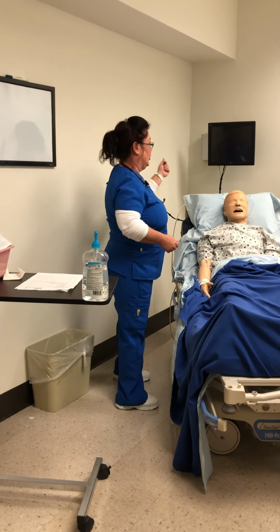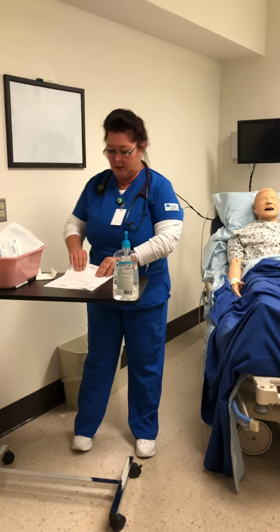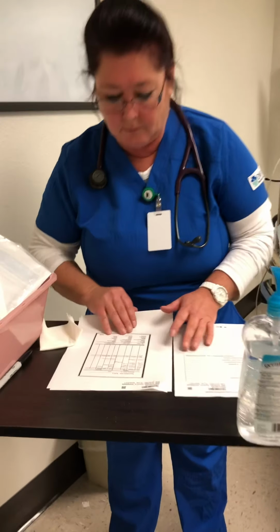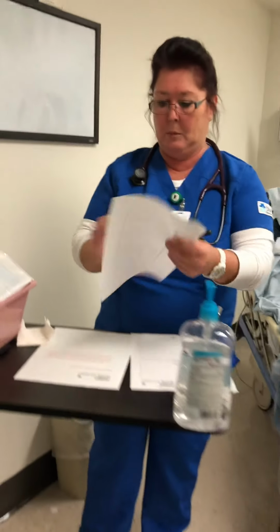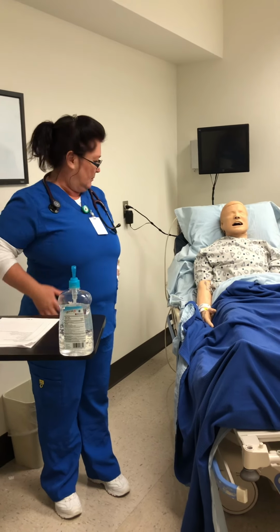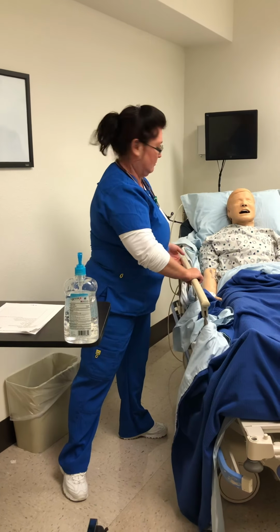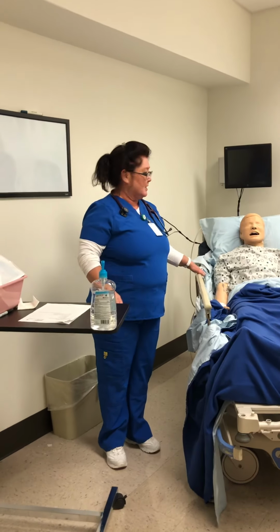So I've unhooked from the suction, and I've got the numbers that I need. So I'm going to come over here, and I'm documenting. I have totaled everything up. And I am putting, whoops, before I leave the room, I'll put the bed rail back up to keep her safe in bed. Shirley's good, and you have a fabulous day. Thank you.